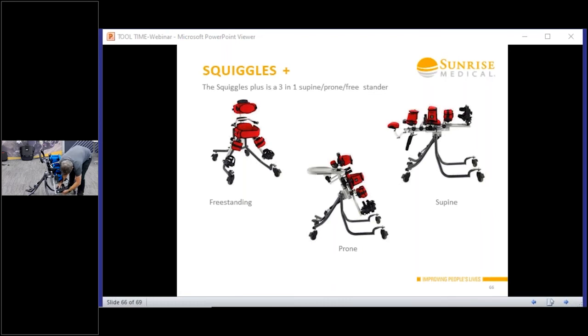And this is the reason it's made so easy: it's designed so that parents can change it at home and not feel that if it's too hard, they're not going to do it. So it's about having that interaction, giving that support. And then you can pop the tray in from the other side.